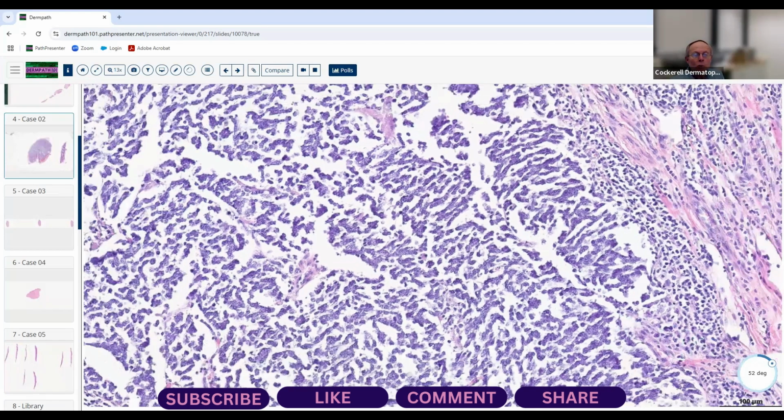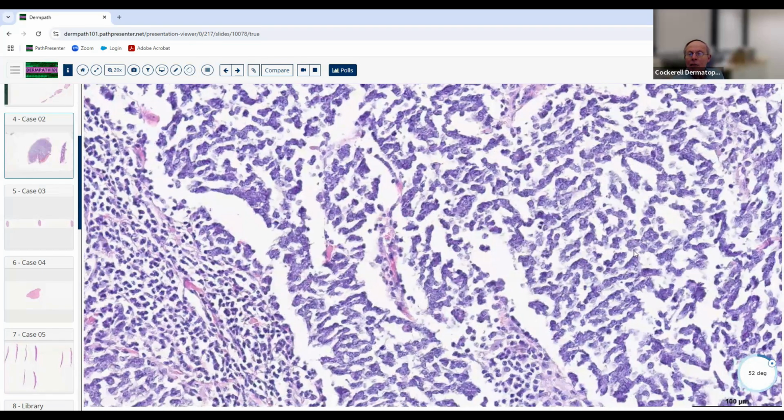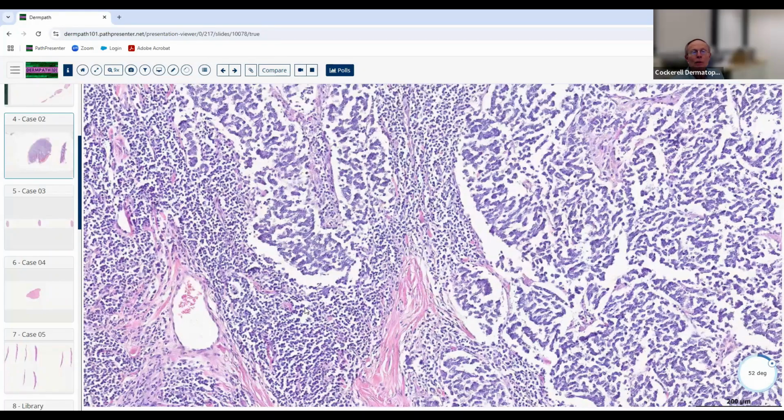And maybe if we scroll around, we might see a few more cells that have some of those little dots. Those are the little small dots of cytokeratin that you will highlight when you do the cytokeratin or the cytokeratin 20 stain. So when you actually look at that stain, you'll see this nice, beautiful little dot, and it correlates to those little small pinkish aggregations that you can barely see with routine H&E staining. So if it's positive, and it is positive most of the time, that's very helpful.